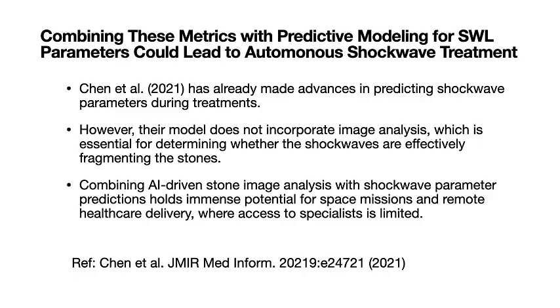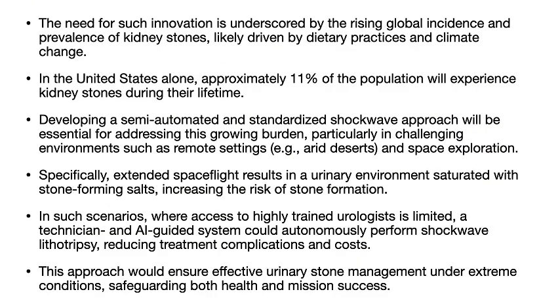The need for such innovation is underscored by the rising global incidence and prevalence of kidney stones, likely driven by dietary practices and climate change. In the United States alone, approximately 11% of the population will experience kidney stones during their lifetime. Developing a semi-automated and standardized shockwave approach will be essential for addressing this growing burden, particularly in challenging environments such as remote settings, e.g., arid deserts, and space exploration.